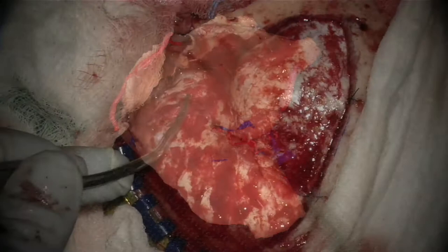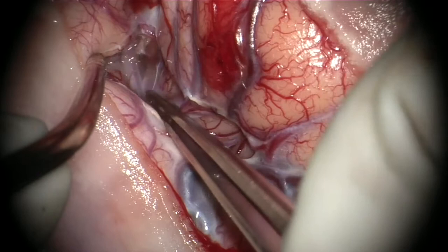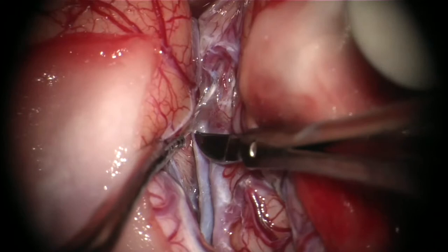Here we have done a pterional craniotomy. We start opening the sylvian fissure. The patient is positioned as a conventional pterional craniotomy. The sylvian fissure is gently opened. We start finding the M2 branches which we follow and separate from each other. Here we start seeing the inferior insular sulcus.